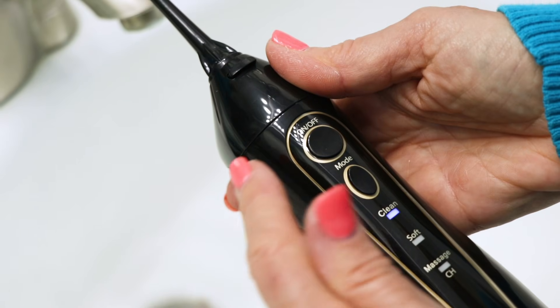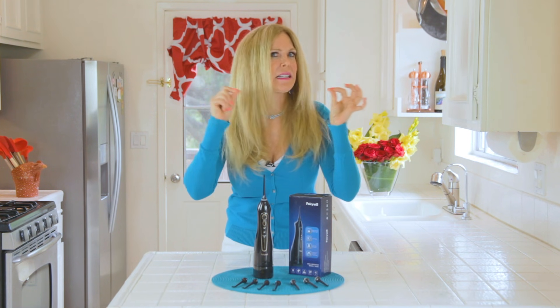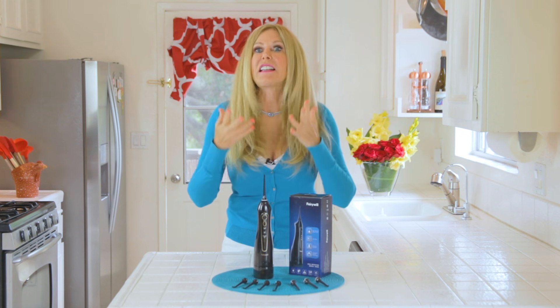This is a review of a water flosser. I researched the internet because I really needed one. For me, I no longer can floss my teeth the old-fashioned way because I've had a lot of dental work done. Kids with braces can't floss everywhere, and people that have had a lot of dental procedures, bridge work, and other appliances aren't able to floss.